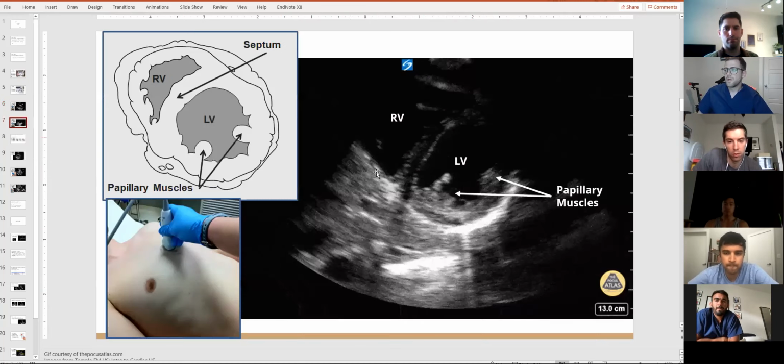Okay. Parasternal short axis view, we're turning 90 degrees. So the probe marker faces the left shoulder of the patient. The way I think it's most helpful is you find your nice parasternal long axis view, whatever is directly down the middle of the parasternal long axis view, that's what's going to show up on the parasternal short. And so you take one hand and have it in a nice parasternal long and physically turn it to the parasternal short. So here we're seeing a variety of things.